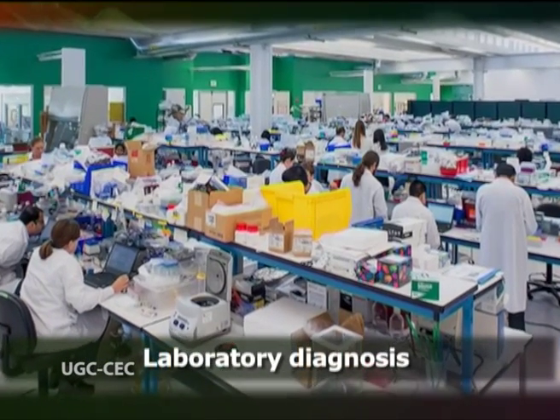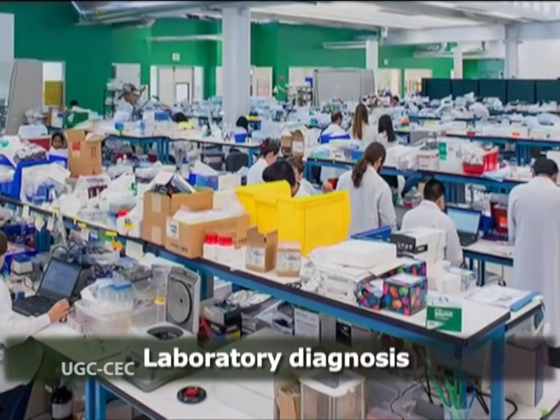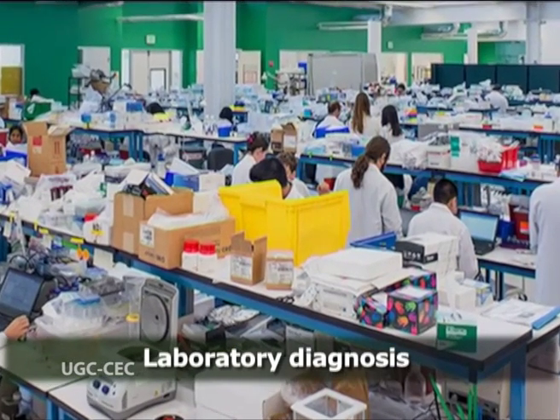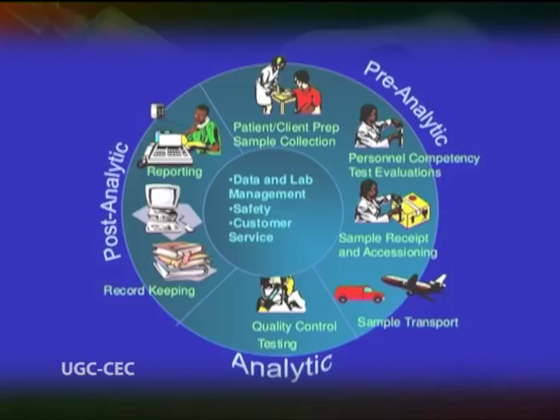Laboratory diagnosis is also essential for effective infection control in both the hospital and community settings, as well as providing invaluable epidemiological data. Clinicians, including nurses, doctors, and professionals allied to medicine, have responsibilities for the collection and safe transport of samples to the laboratory.